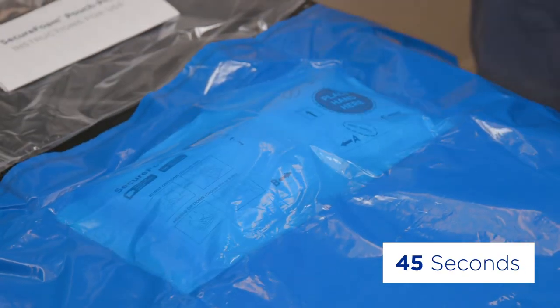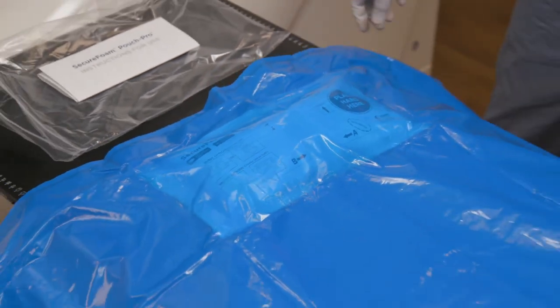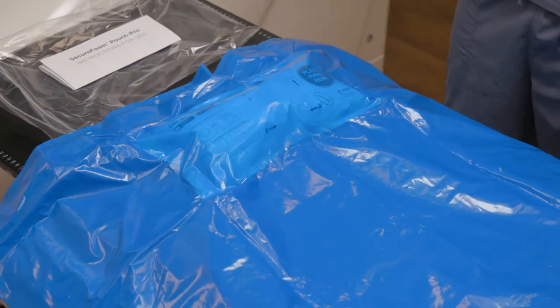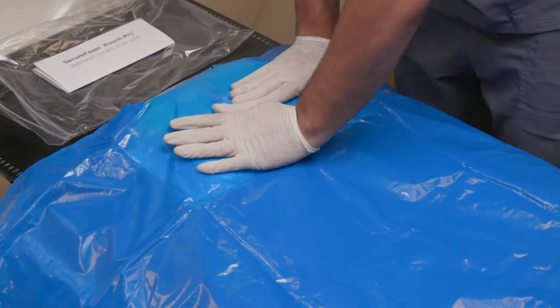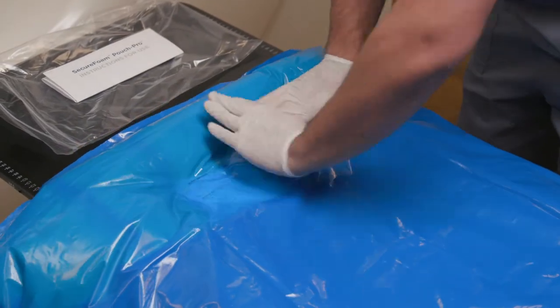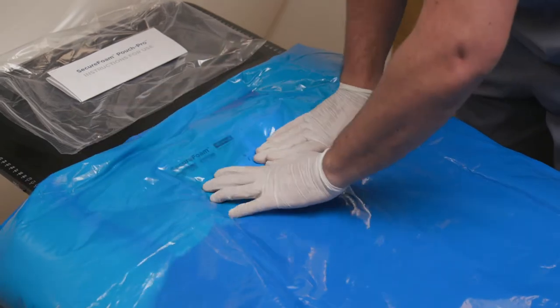About 45 seconds after breaking the seal, the bag will begin to feel warm. Then, about 60 seconds after breaking the seal, the inner pouch will burst, releasing its contents into the foaming bag. Quickly push all the contents from the pouch into the foaming bag.